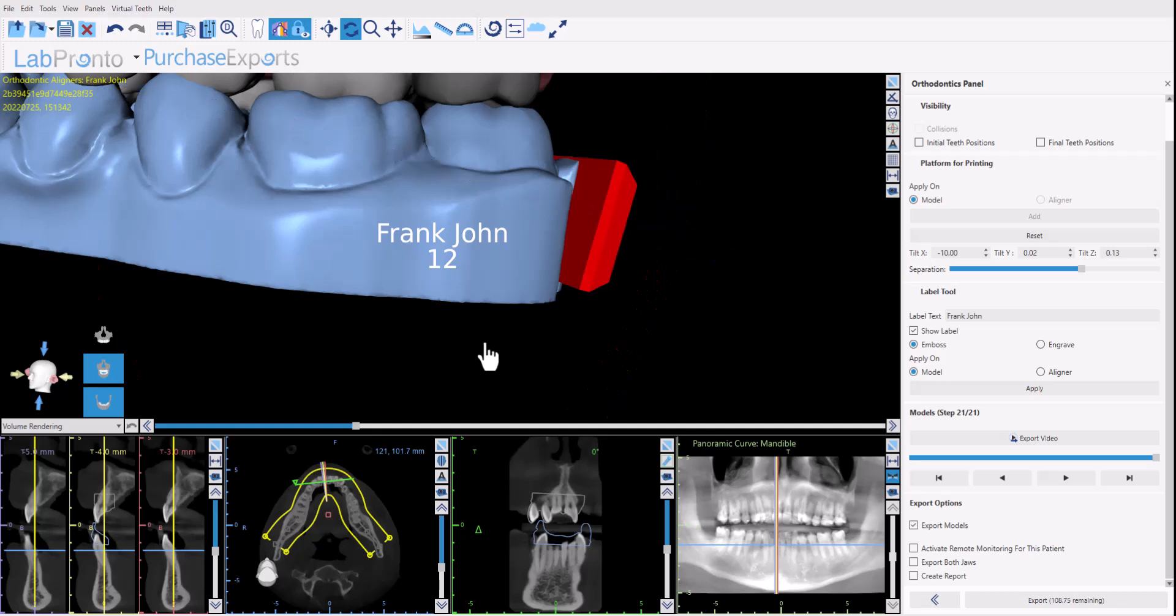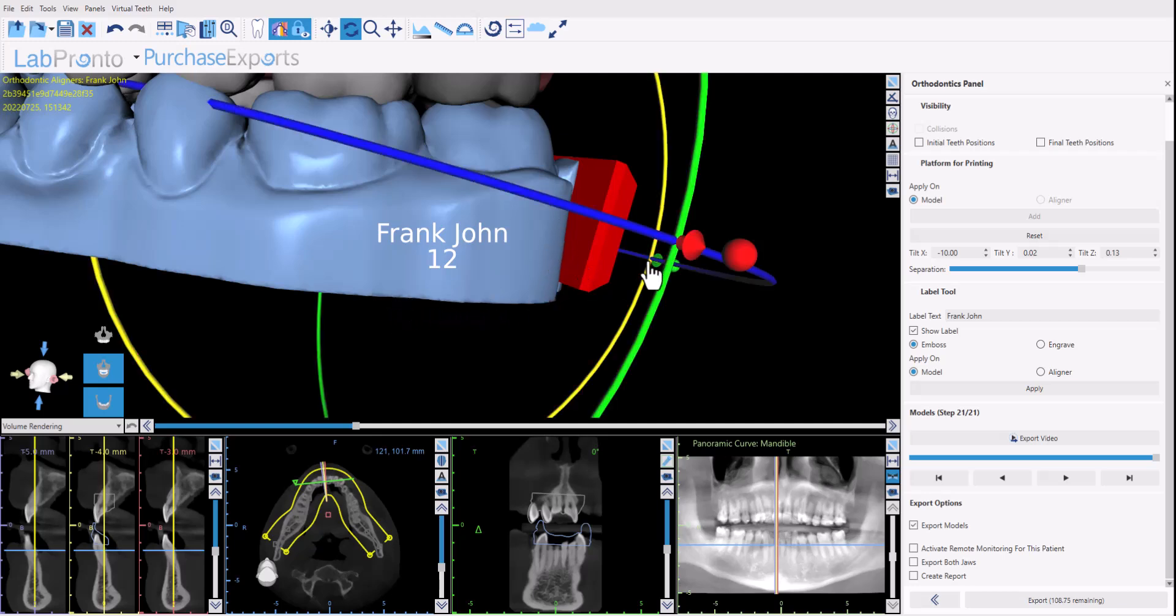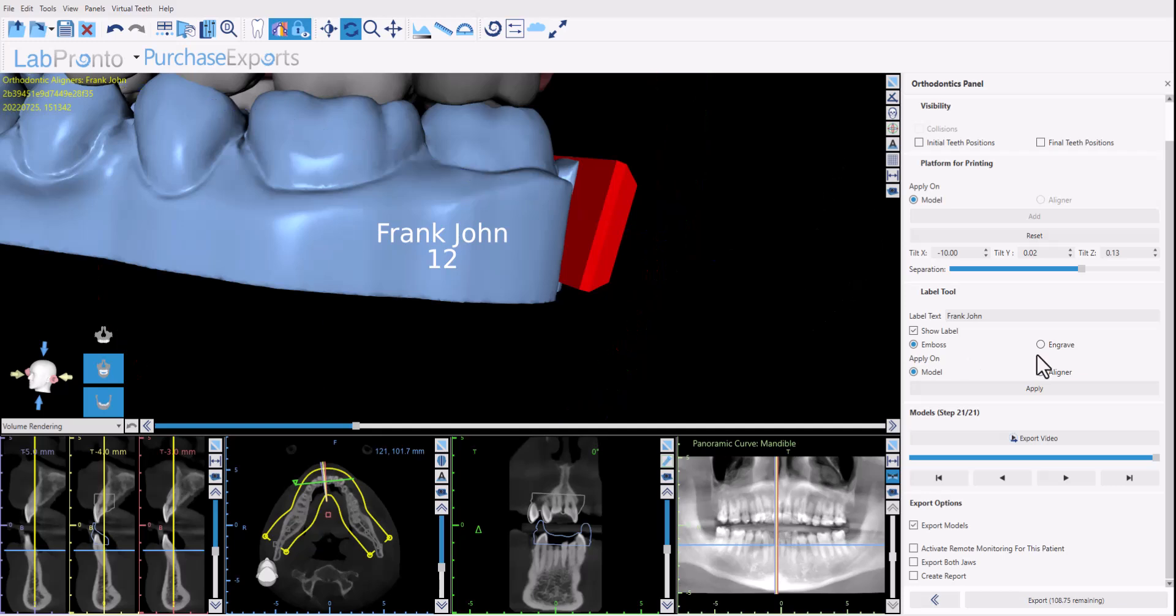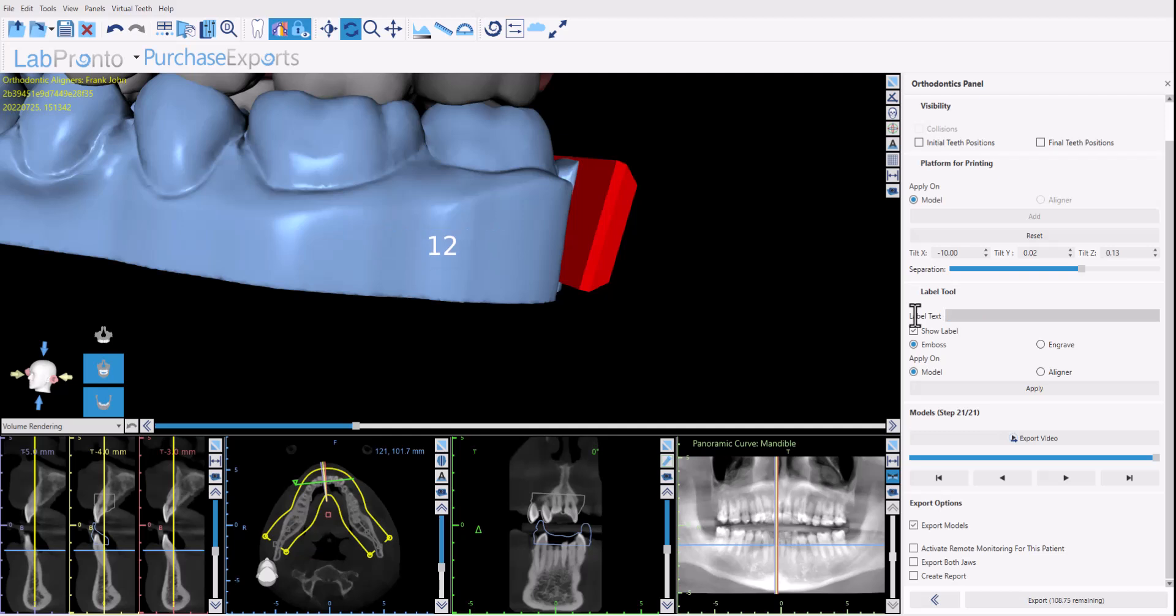Now you don't want to put the text very close to the edges because it might affect the actual printing. So you want to make sure there's a bit of space to any relevant edge. You have the option here either to emboss or engrave the text. You could change the text here if you don't want any text and you just want the model number, just delete the text.